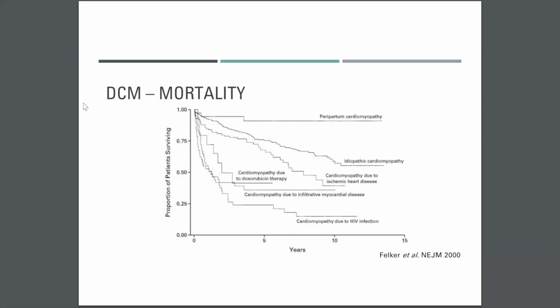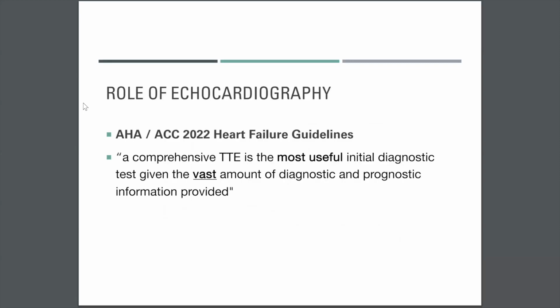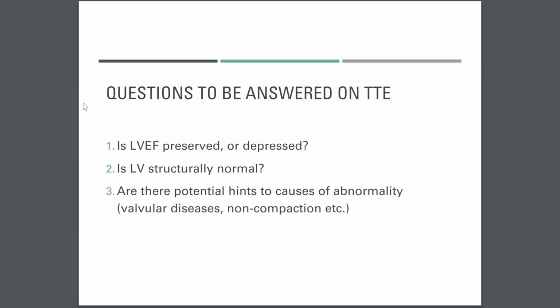Anyone guess what that is? They all need an echocardiogram. So therefore, we'll all have jobs. This is from the most recent heart failure guidelines from the AHA. They specifically mention in the text that a comprehensive TTE is the most useful initial diagnostic test, given the vast amount of diagnostic and prognostic information provided. So it's a bit of an ego boost for us.